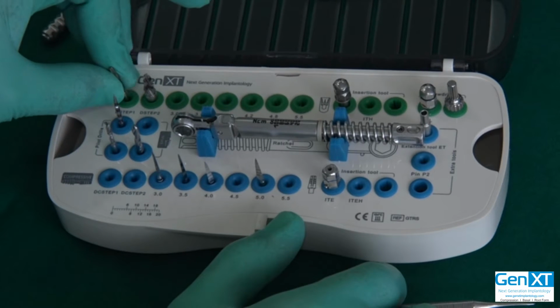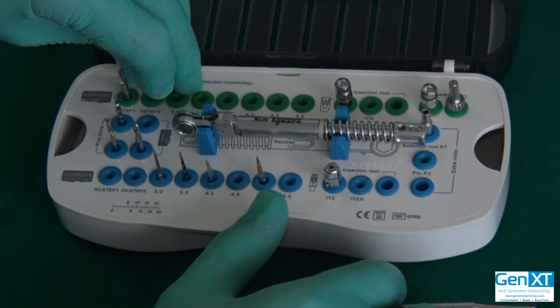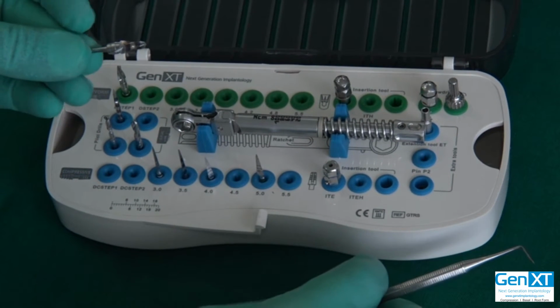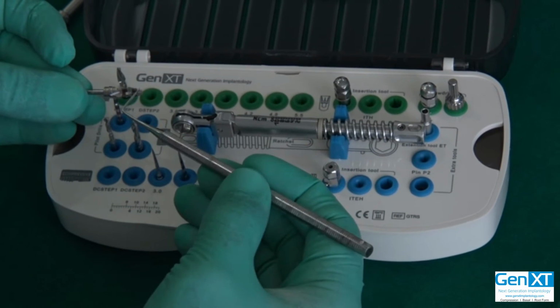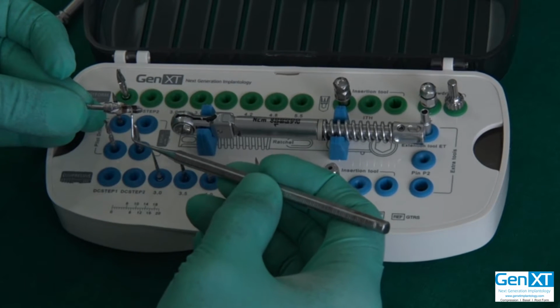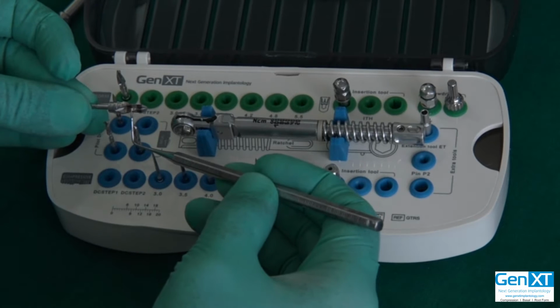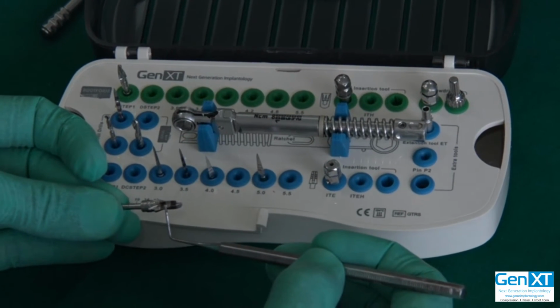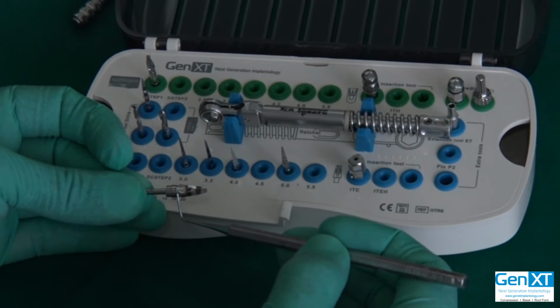Once you have done this up to the full depth, if you are placing a 3.8 or a 4.2 or a 5.5, this is the additional drill that we have only to widen the crest. This is also graduated here. Once again, the first marking is the 3.5. The second marking is for the 3.8. Then is for the 4.2. Then is for the 4.8, and on the top is for the 5.5.